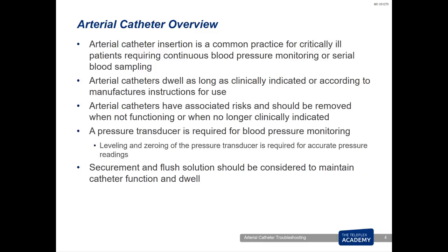Arterial catheter dwell really depends on how you're using them and what you're monitoring and who is doing maintenance of these devices in your facility. Arterial catheters have associated risks and benefits and really should be removed when no longer functioning or no longer clinically indicated. The practice of having catheters idle for just-in-case procedures is no longer clinically warranted.